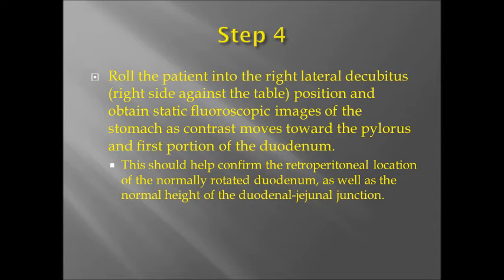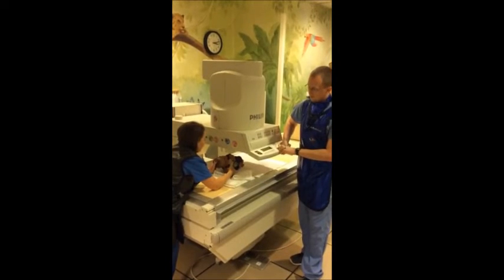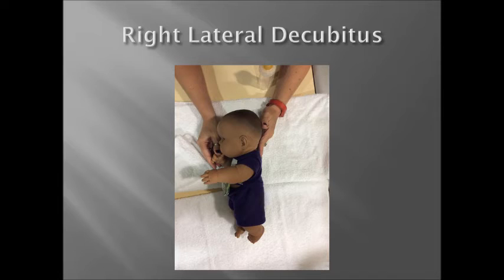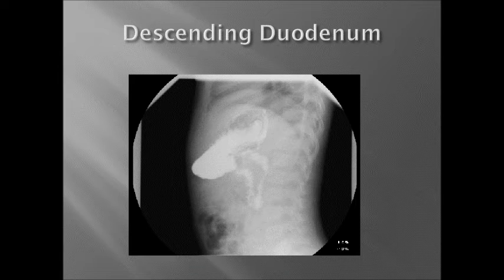Step 4: Roll the patient into the right lateral decubitus position, with the patient's right side against the table, and obtain static fluoroscopic images of the stomach as the contrast material moves towards the pylorus and first portion of the duodenum. This should help confirm the retroperitoneal location of the normally rotated duodenum, as well as the normal height of the duodenal-jejunal junction. Here is an example of right lateral decubitus positioning, and a static fluoroscopic image demonstrating the normal height of the duodenal-jejunal junction.